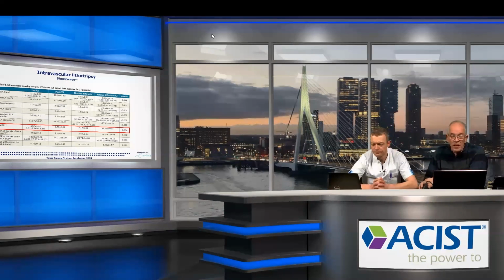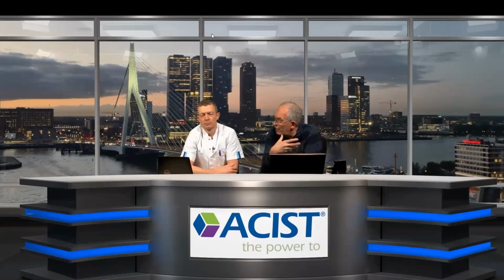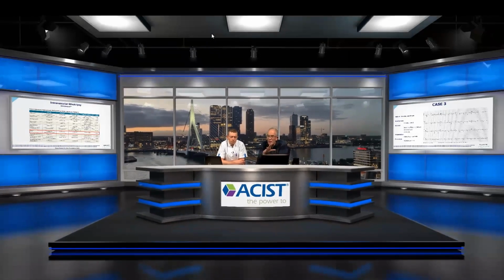Sure. That's what we saw indeed. If I would do a résumé of what we learned today, and what you said, well, we selected some shockwave cases because these were good illustrative cases. Whatever you use, rotablator, shockwave, orbital atherectomy, or just an NC balloon, the important key issue is to check your work. Did it do what it should do? And if it didn't, be reluctant to place your stent before trying to improve the result.